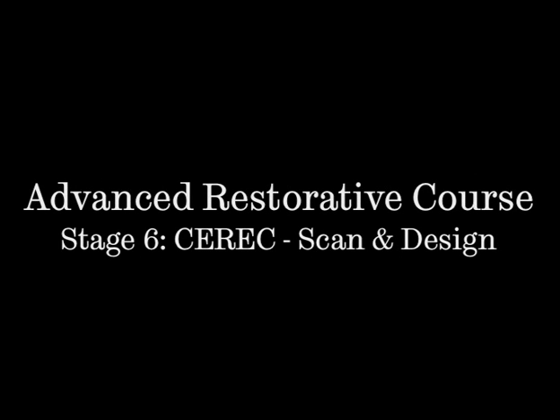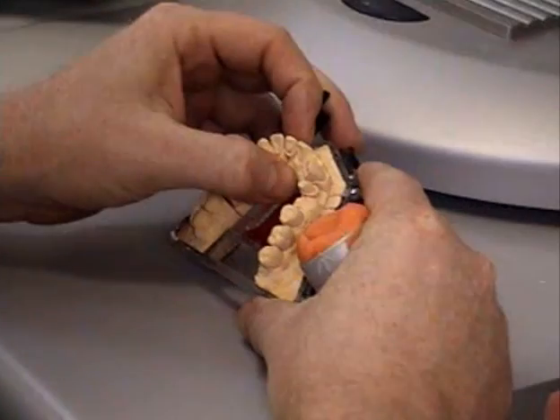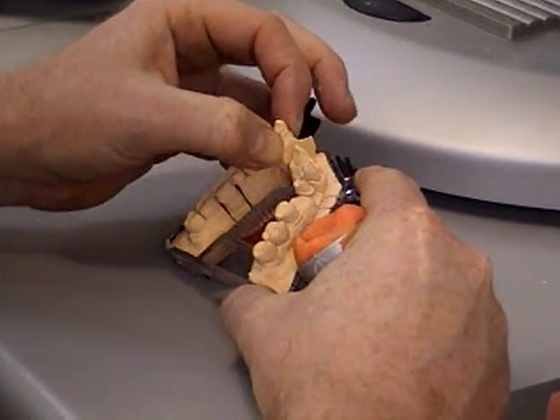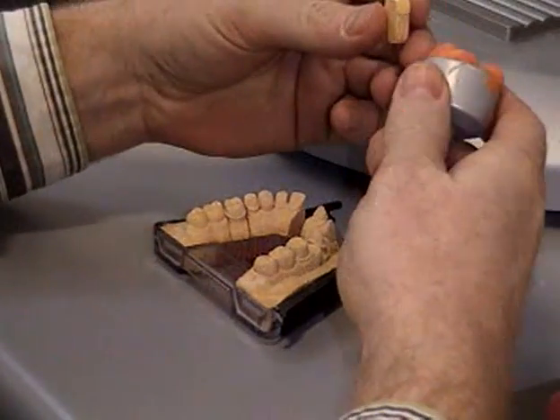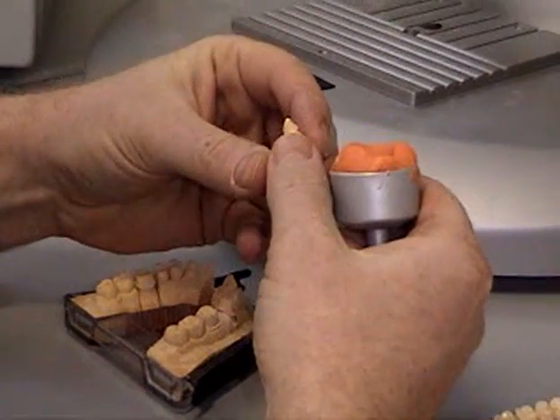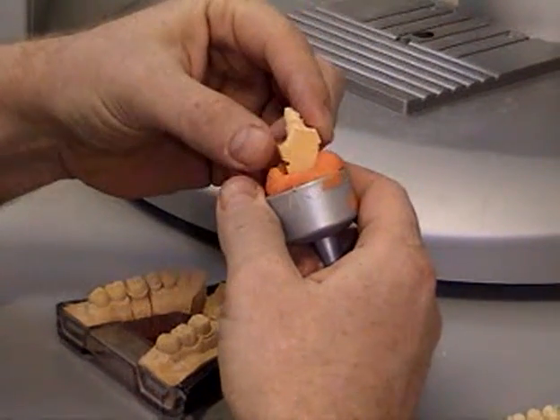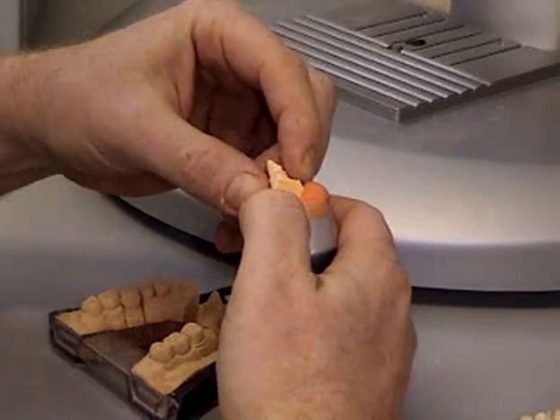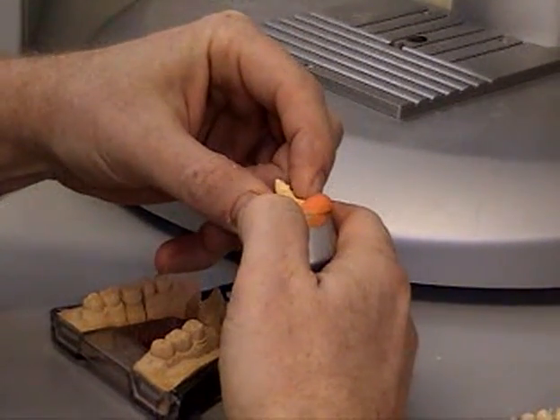In this stage we're going to look at the scan and design process for the CEREC CAD CAM system. So the die is removed from the model and needs to be mounted into the scanning cup using, in this case, an orange plasticine material that holds the die firm.